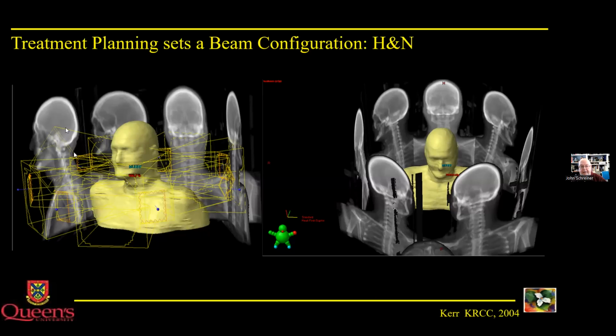And then this is sent to the treatment planning system. In the treatment planning system, we simulate radiation coming in from multiple directions, depending on the treatment, and the system will calculate what the doses being delivered will be like.